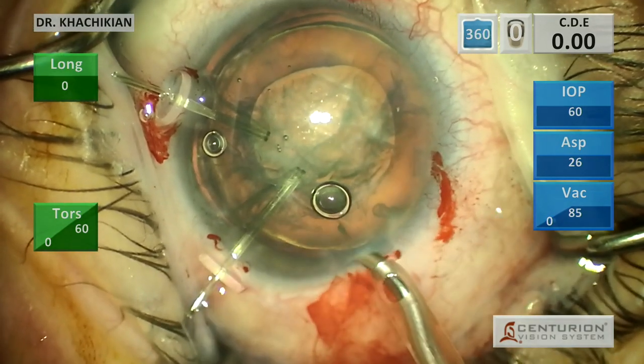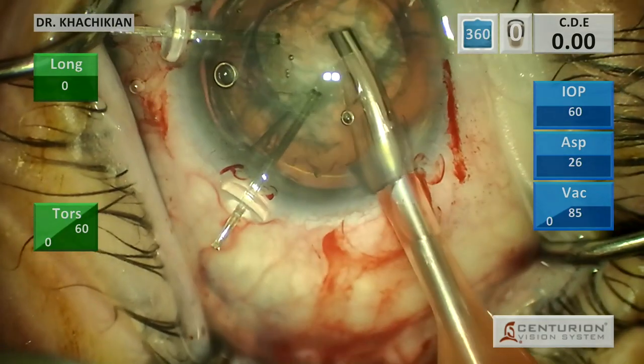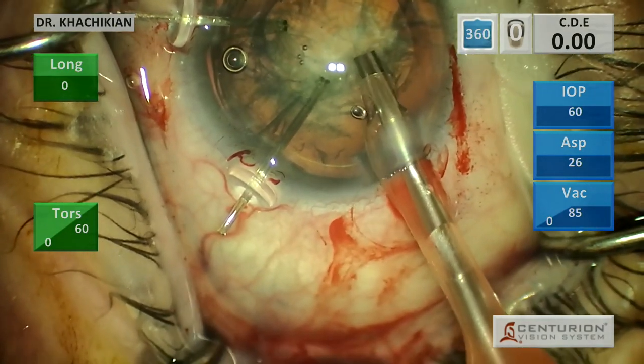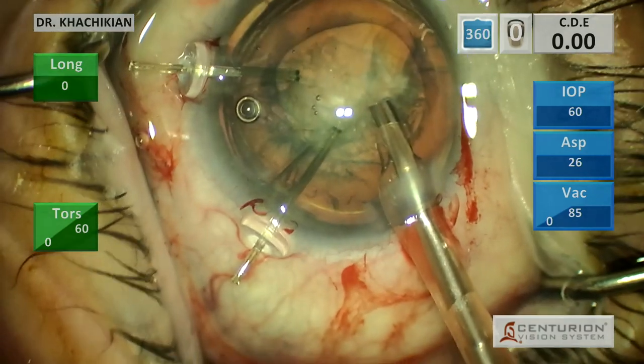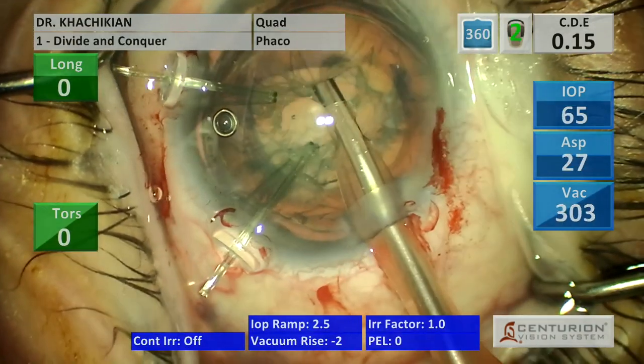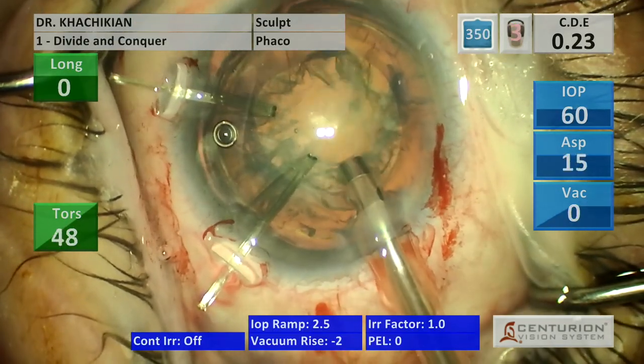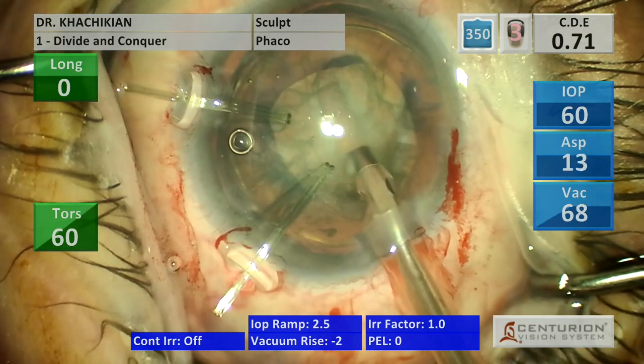Now we're going to put more viscoelastic in and work on our takeover. You can see that hook being moved by the lid speculum superiorly there - that's annoying because it causes the hook to move inside the eye. So we're going to use a quadrant approach, remove some viscoat that we placed in, and also enter the anterior capsule. Now we're going to do some gentle sculpting.